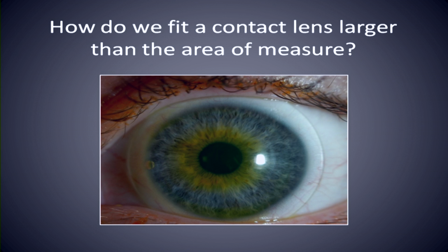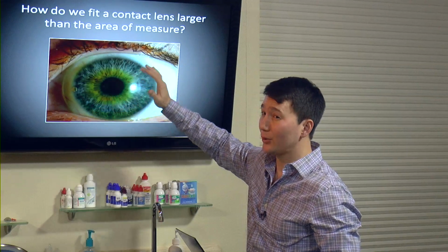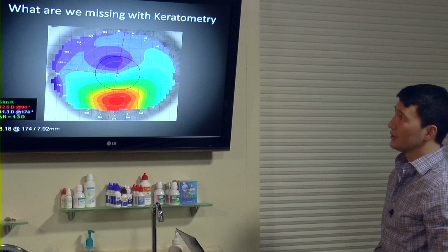Now a question becomes, we're talking about corneal GPs, but boy, Scleral is just dominating the publications. It's dominating the symposia. So we're really moving in that direction, and certainly we can see at Valley Contax that's the direction that Valley's been moving with their big line of scleral options. So can we use a corneal topographer to fit a scleral lens? If the corneal topographer measures cornea, but the scleral lens fits beyond cornea, can it be used? So let's share some thoughts.